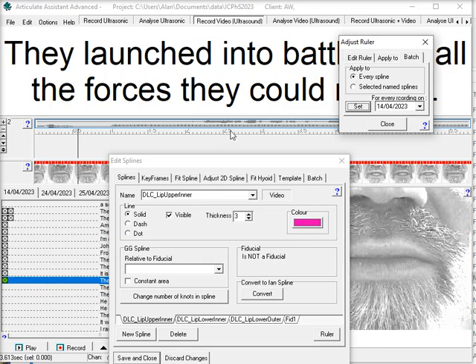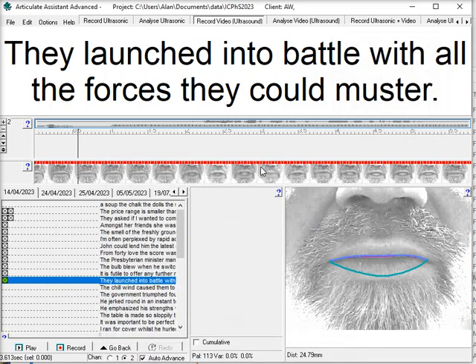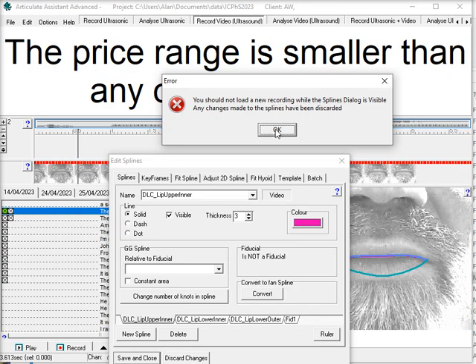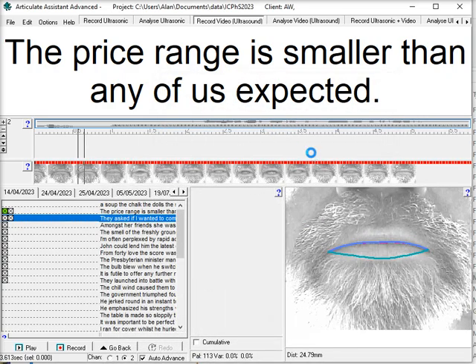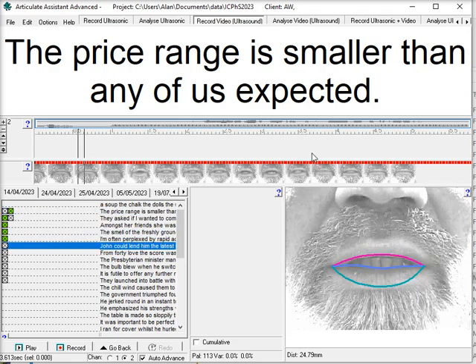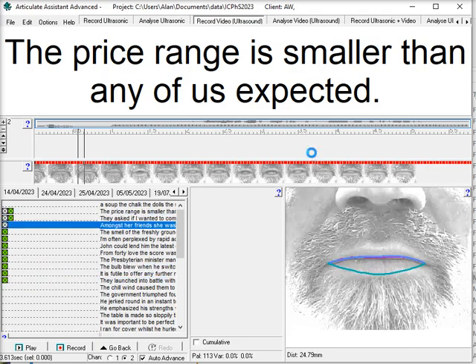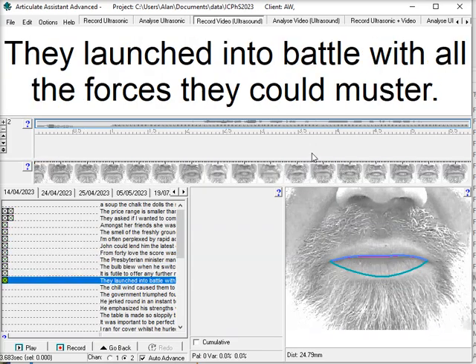And here we have, it will perform the operation. Just click through these little messages. You can see it moving through all of these recordings. Once it's finished, it will stop changing the recording. Now if we measure, drag from the bottom here to the top, we see that it's reading 70 millimeters. So all of these splines are now correctly scaled.